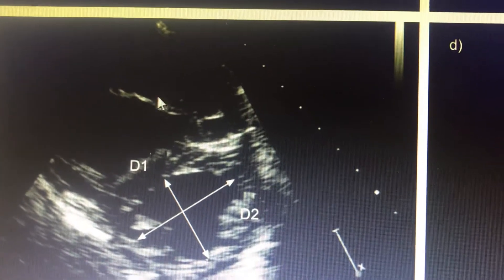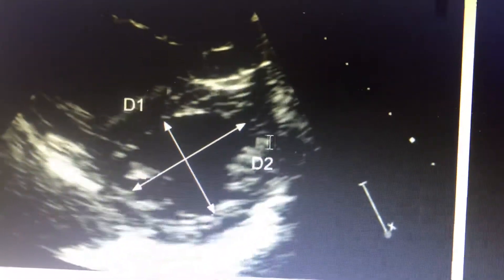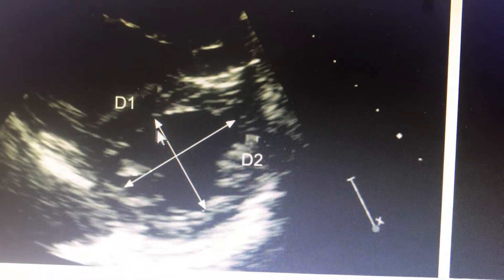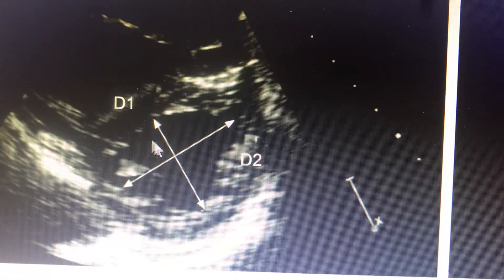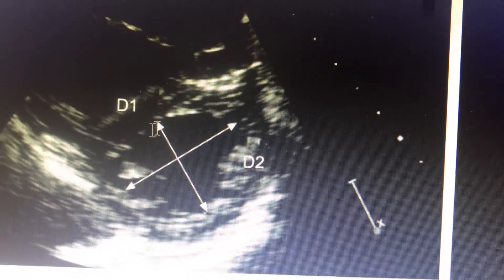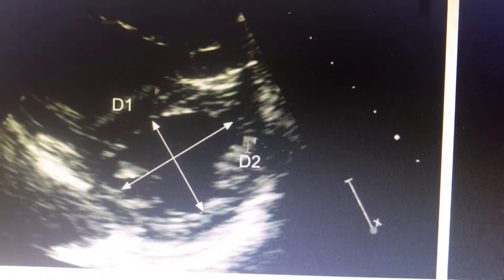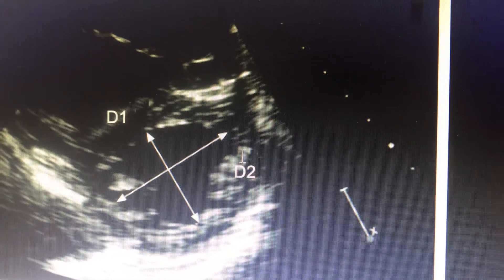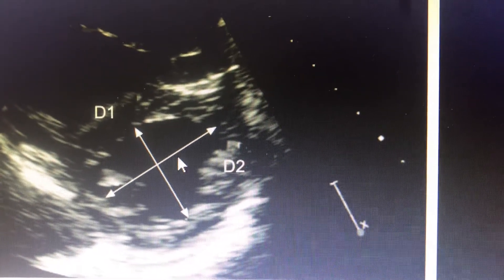Here you can see the RV is hugely dilated, and this is the diastolic dimension of the LV. The minor axis dimension perpendicular to the septum is called D1, and the one parallel to the septum is called D2. LV Eccentricity Index is calculated as D2 divided by D1.